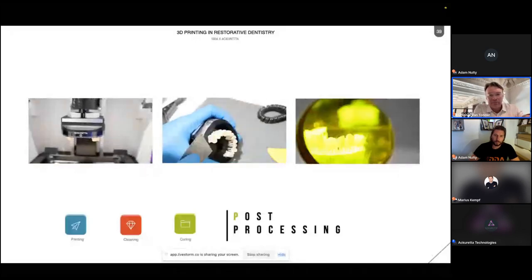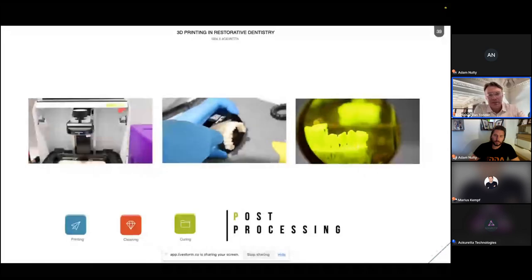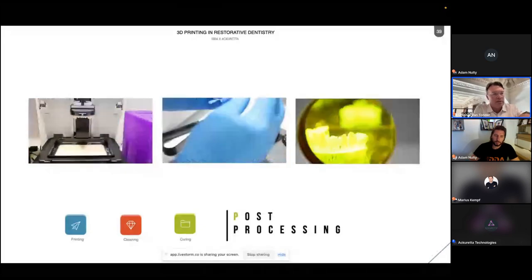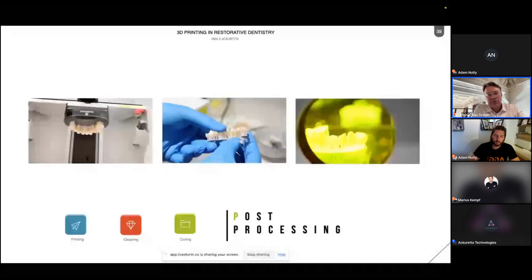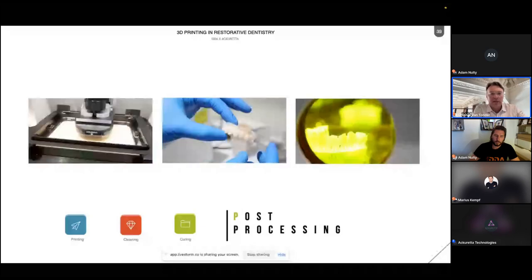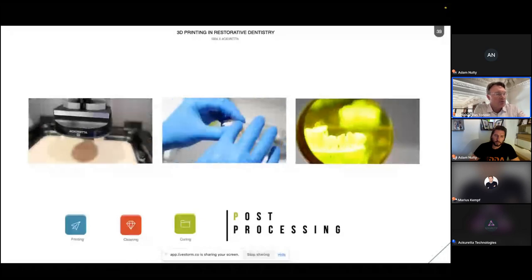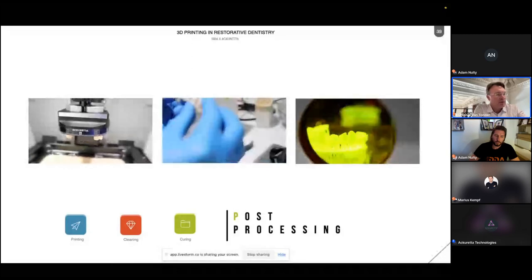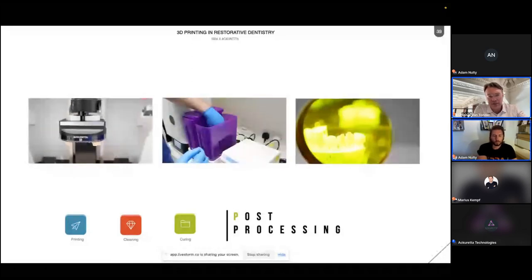But also, the way the systems are laid out is really, really easy to use. Once again, like I said at the beginning, I want this to be so easy that my staff can take this bit away from me and I can just focus on what I'm doing for the next patient. So after we've done our cleaning and our curing, we do our sprue removal, and I do a final polishing, and then I do staining and glazing.